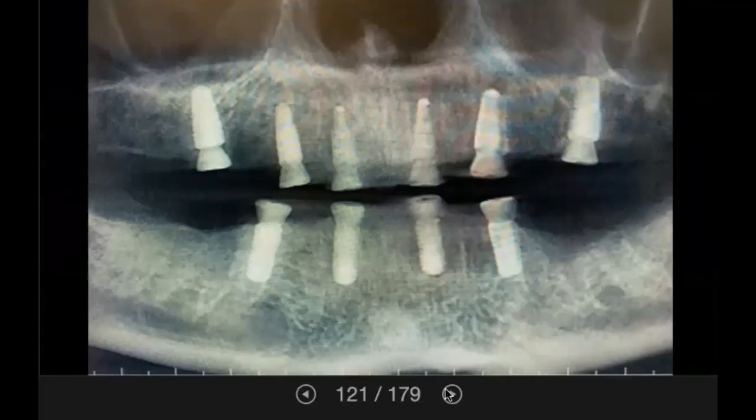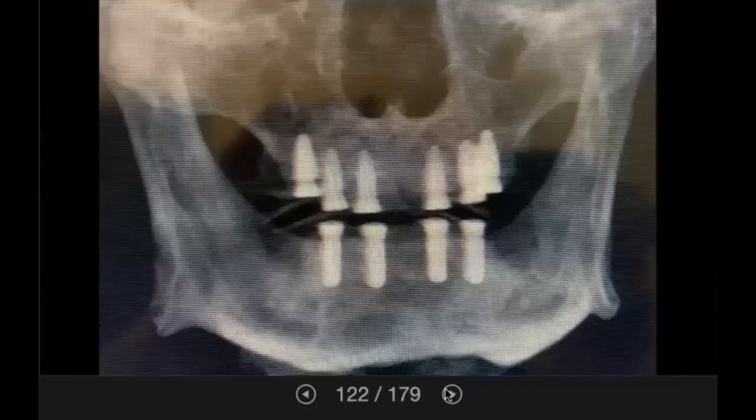larger diameter implant. The primary stability of the implants, as dictated by the insertional torque value, is a predictor of implant success. Implants with a low insertional torque value have a significantly lower survival rate than implants with a higher insertional torque value. All implants are spaced ideally for maximum anterior-posterior spread and cross-arch stabilization.